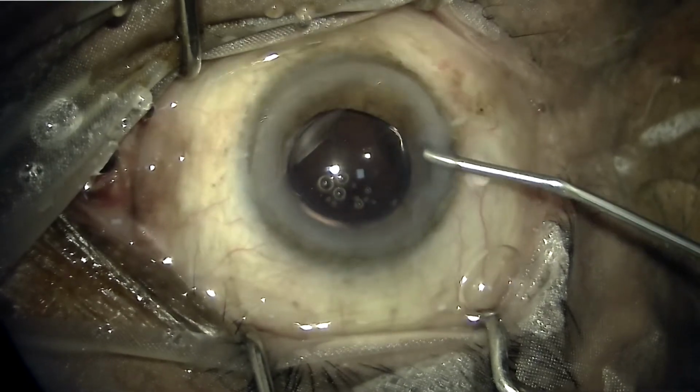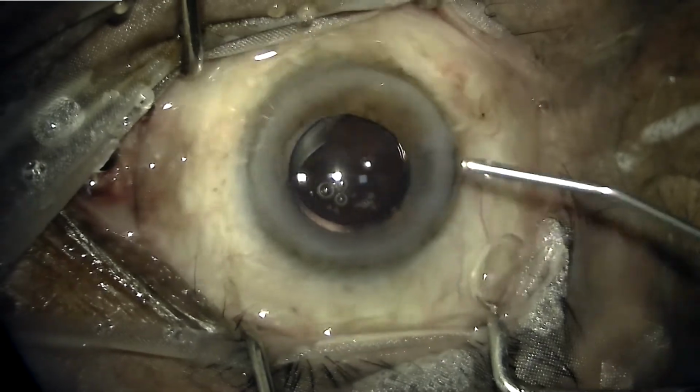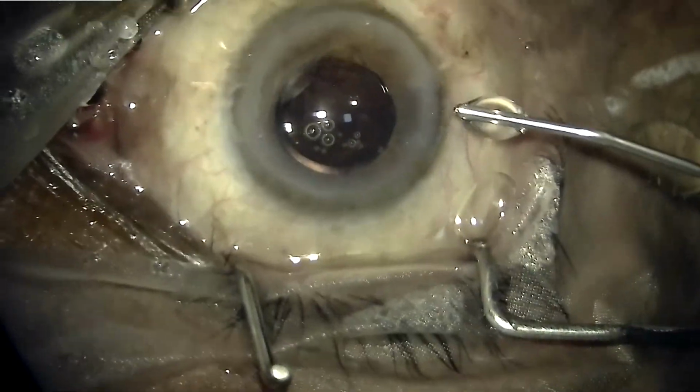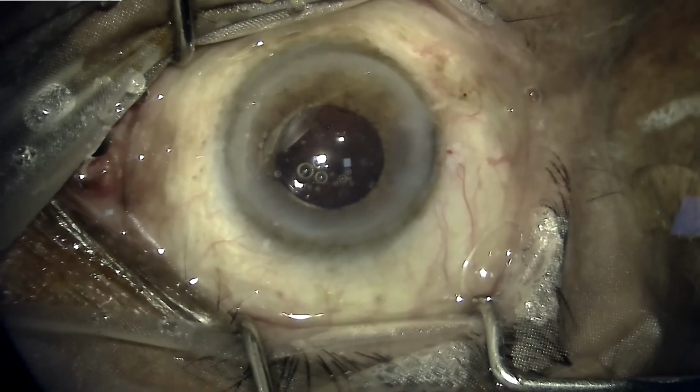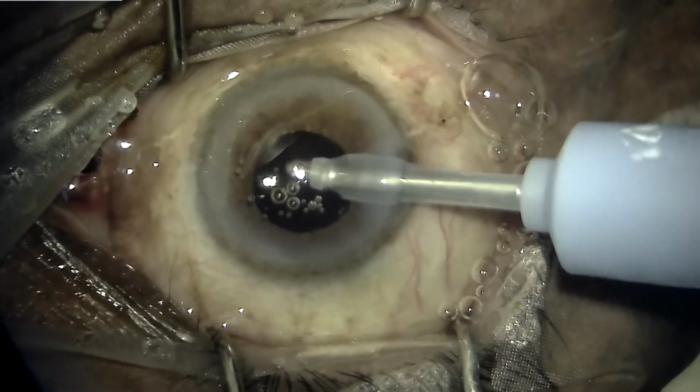Pilocarpine is to be injected to make sure that there is no vitreous strand. I prefer to dilute my pilocarpine to half the dilution, and this reduces the pain as experienced by the patients when this is being injected in the anterior chamber.